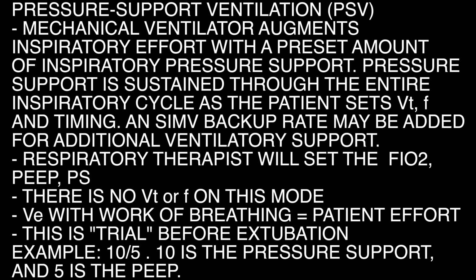The respiratory therapist will set the FiO2, PEEP, and PS. There is no VT or F in this mode. Work of breathing equals patient effort. This is a trial before extubation. Example, 10/5: 10 is the pressure support, and 5 is the PEEP.